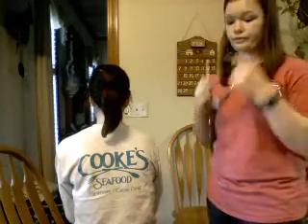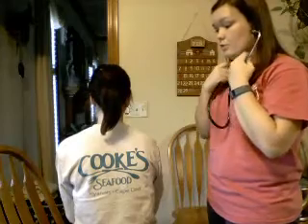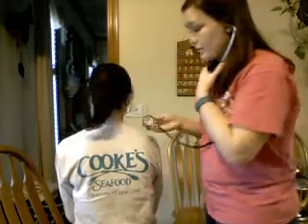And next I'm going to be auscultating. So I'm going to be listening to all of her lung sounds on her posterior side right now. So I'll just have my patient take a deep breath in and out each time I move my stethoscope to a new spot on your back. Okay.